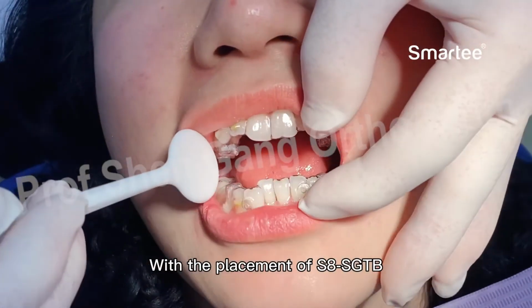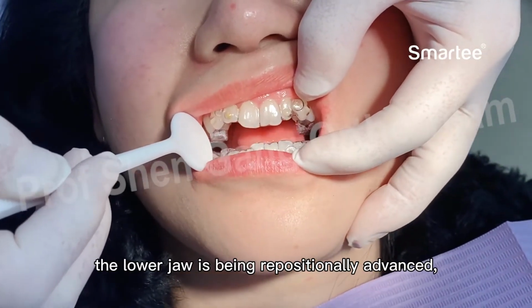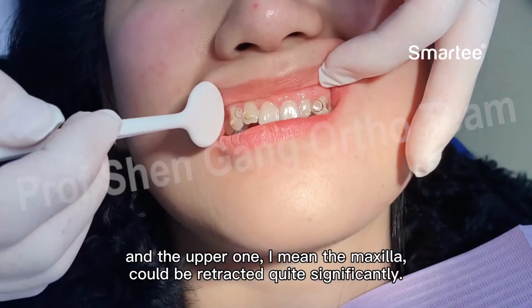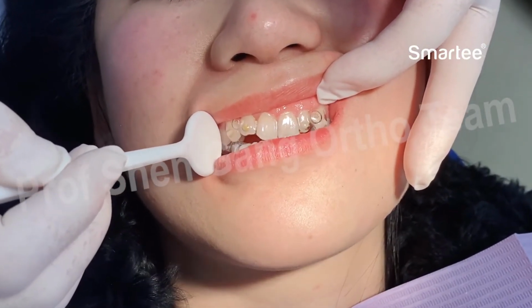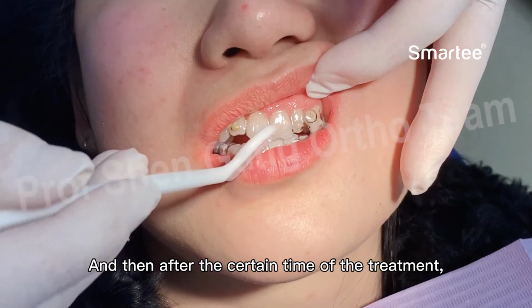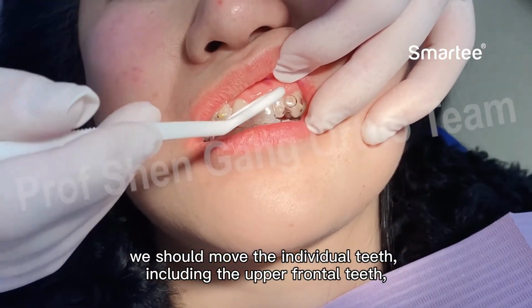With the placement of the S8 SGTB, the lower jaw is repositioned and advanced, and the upper one, the maxilla, could be retracted quite significantly. After a certain time of the treatment, we should move the individual teeth, including the upper frontal teeth.